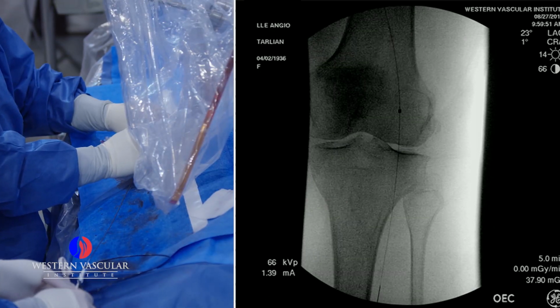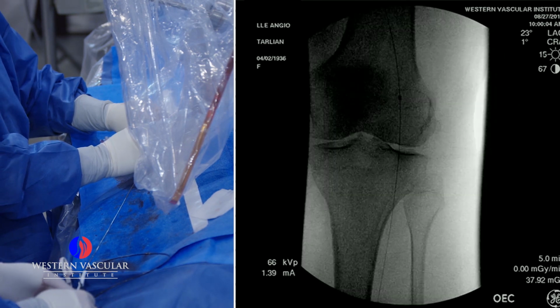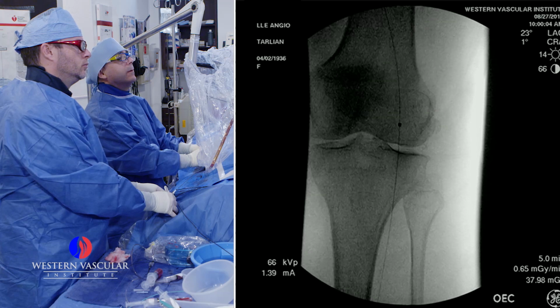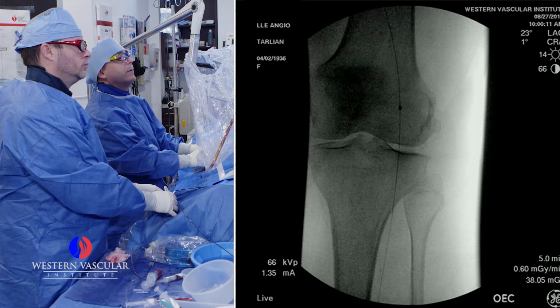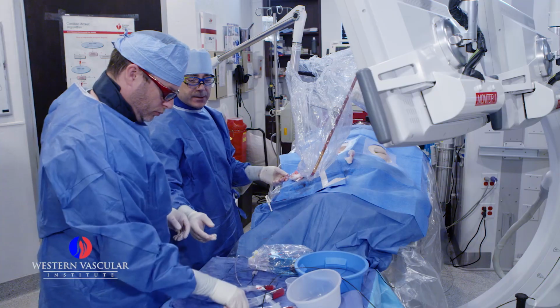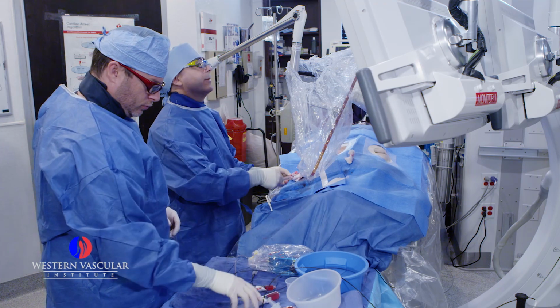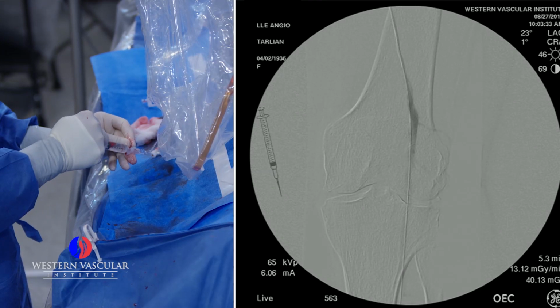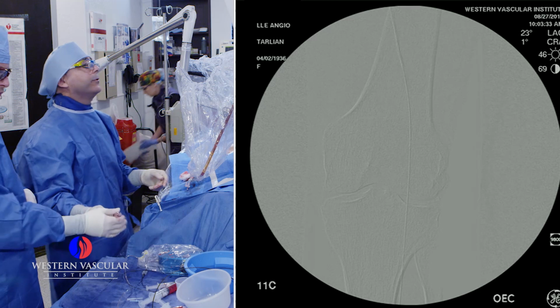And we advance the laser roughly 2 millimeters per second. Live, please. Live, please. So we're going to take a quick picture here with a little bit of dye since we'll get a better image. Okay, good. I don't see any issues there.